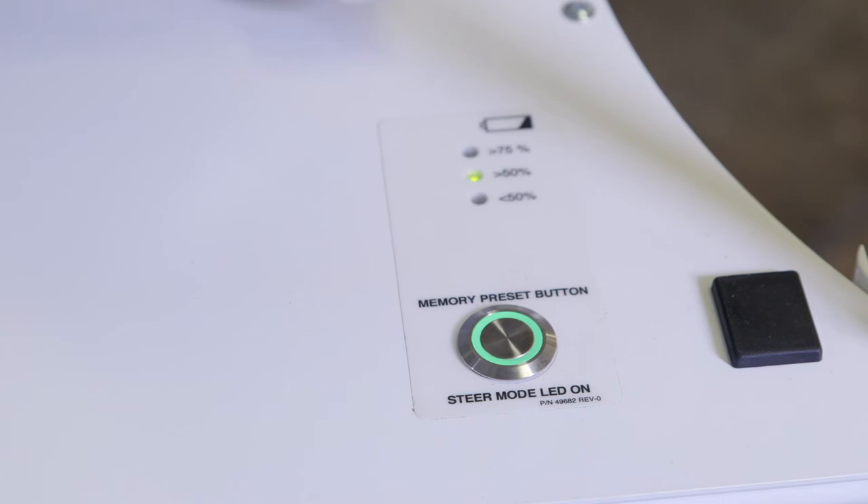You'll notice that your eGurney wheeled stretcher has battery indicator lights. There are three lights: greater than 75%, greater than 50%, and less than 50%. If your battery has less than 50% power, an amber light will appear. Greater than 50% and greater than 75%, the green lights will show. Always remember to charge your battery every night.